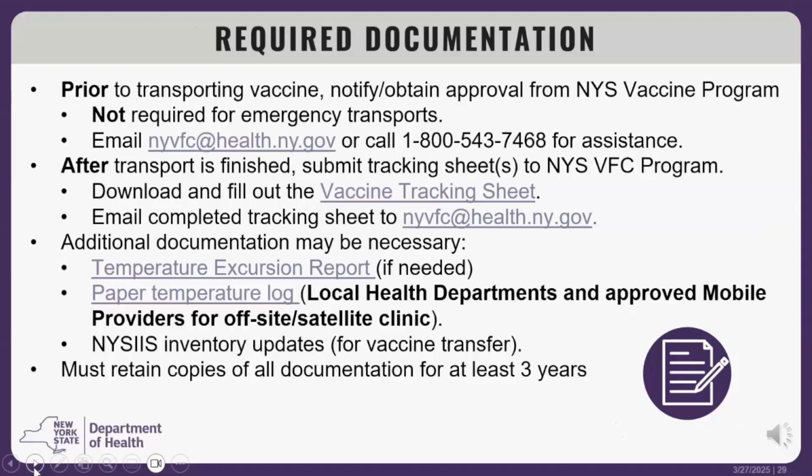For local health departments transporting to off-site clinics and approved mobile clinics, a paper temperature log must be used throughout the clinic to document temperatures about once per hour. Copies of all documentation must be maintained for a minimum of 3 years.